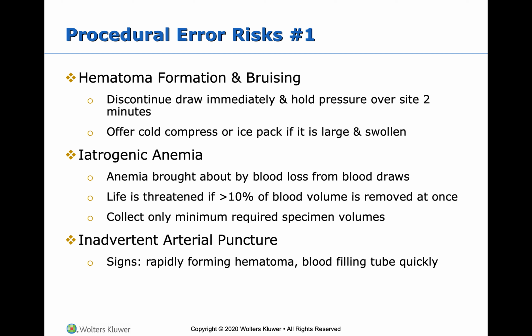Okay, we talked about inadvertent arterial puncture. Obviously, a rapidly forming hematoma will form. Blood will fill the tube quickly or squirt into the tube.